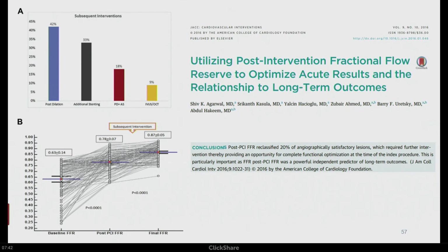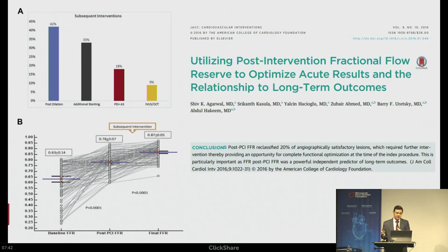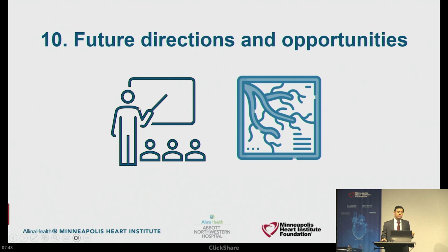Why is it important? One, because as I've mentioned, suboptimal FFR is associated with adverse outcomes, but also because there's interventional data that if you measure it, there are actions that can be taken. To me the best example is with virtual PCI. If you use something like FFRCT virtual PCI and the target FFR was 0.88 and you measured it and you achieved a 0.81, that tells you I'm missing something. And this study elegantly showed this, not with CT, but the same concept, that if you measured it, you identify opportunities for post-dilation, additional stenting, geographic miss, or you need to image more. So if you measure after the procedure, you understand that there are opportunities to do better.